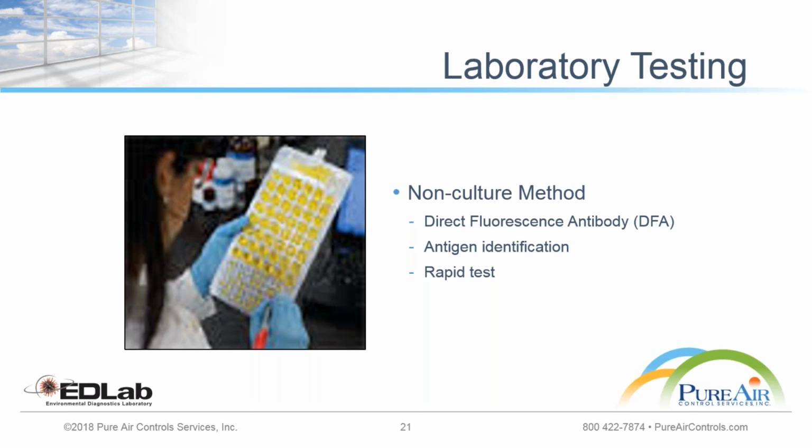One can put the sample in and let it react with the proper antigen-antibody reaction, which can be visualized with a color change, showing whether Legionella is in that water or not.